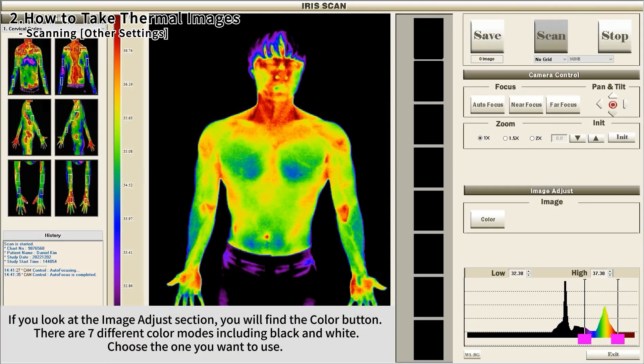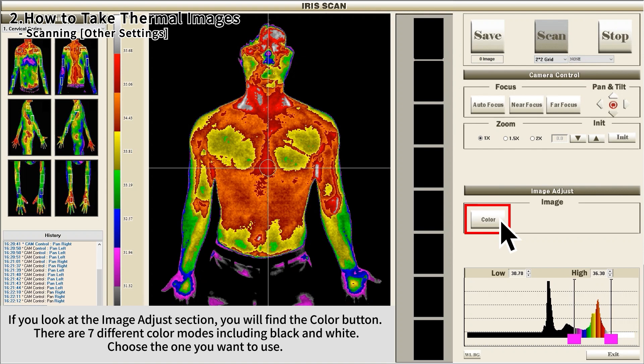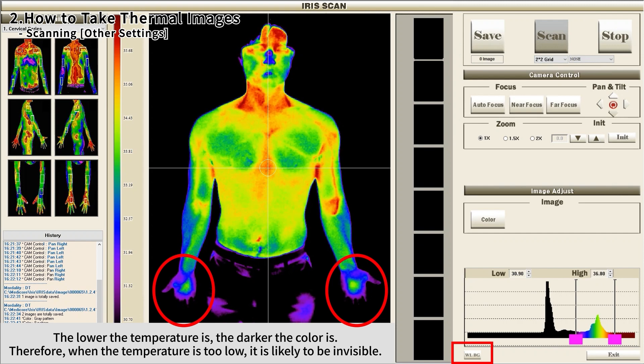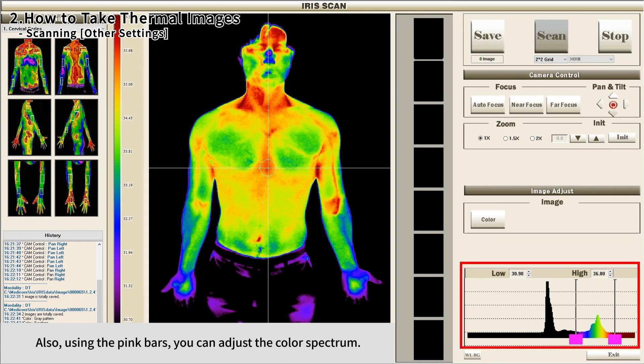In the image adjust section, you will find the color button. There are seven different color modes including black and white — choose the one you want to use. The lower the temperature, the darker the color. If the temperature is too low, it may be invisible. In that case, click the WLBG button to see the boundary of the invisible part, and use the pink bars to adjust the color spectrum.